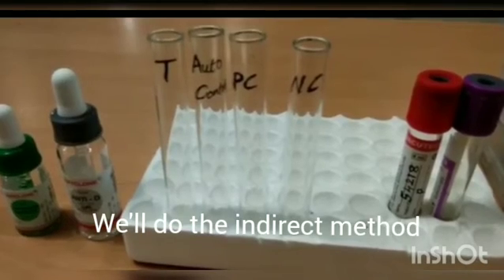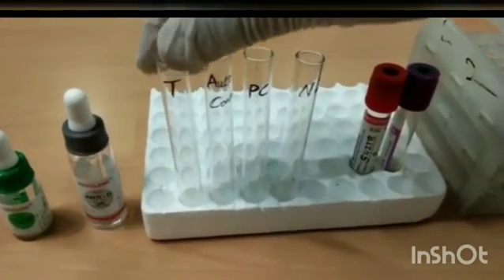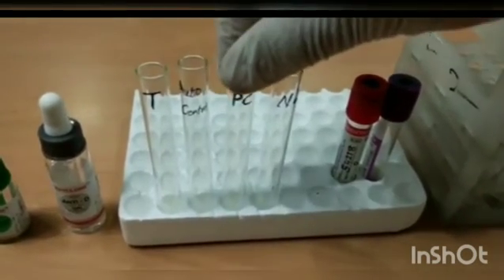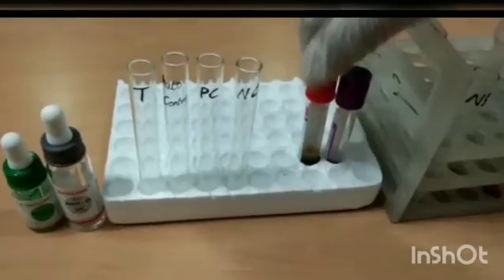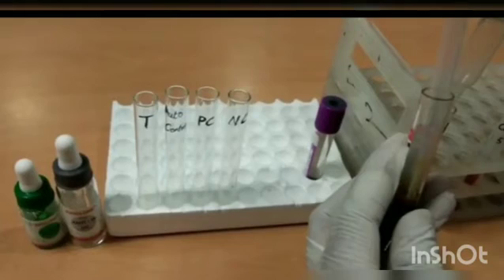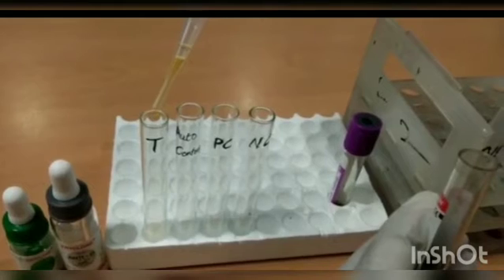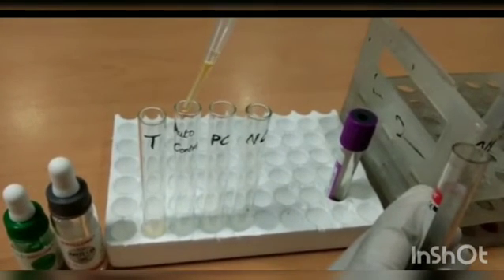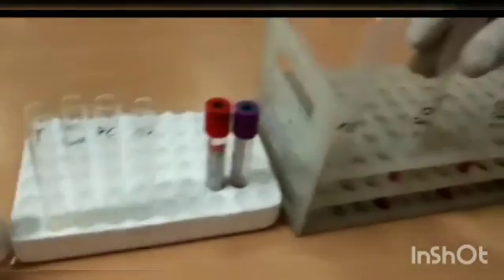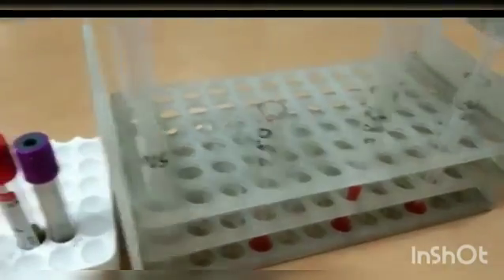We do the indirect Coomb's test now. So take 4 tubes, label them as T for test, and then auto control, positive control and negative control. Then take 2 drops of the patient's serum into the tube labeled T, and then to the auto control, and then add O cells, that is 5% pooled O cells, into the test.